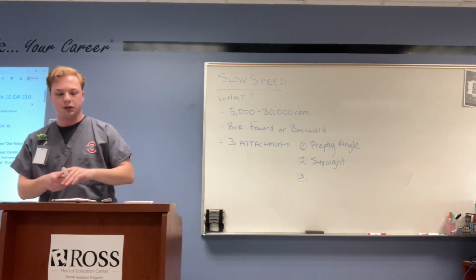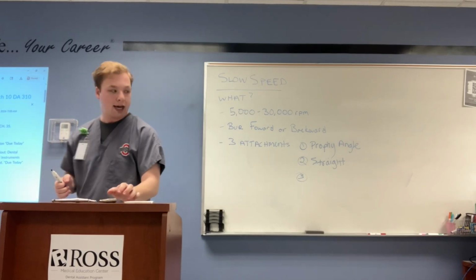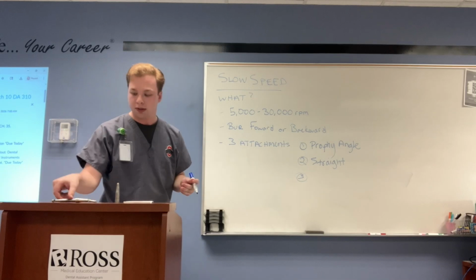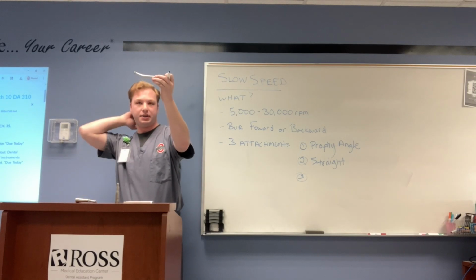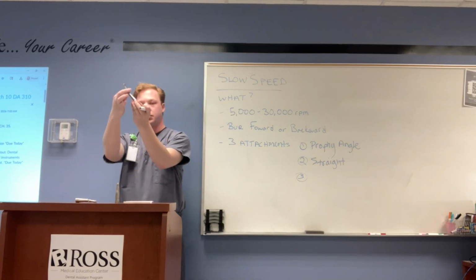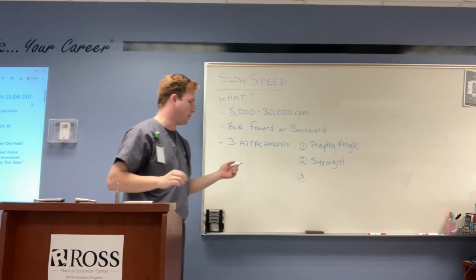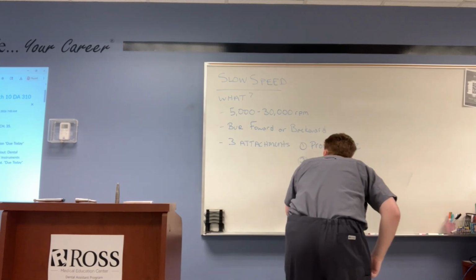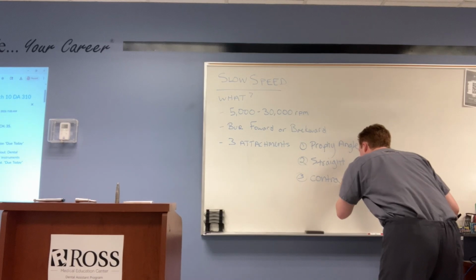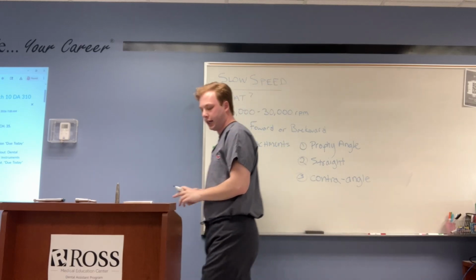The straight handpiece, it literally looks like this. You can make an attachment that looks just like that, just straight. And then the third one is the contra angle. So if you look at this handpiece, you notice how it's straight, but then it curves upward. So that angle is called a contra angle. So you can have an attachment called the contra angle. C-O-N-T-R-A hyphen angle. Contra angle.